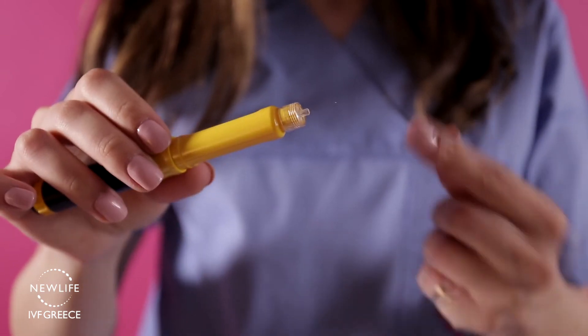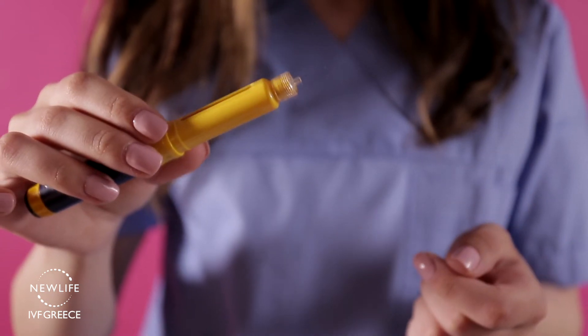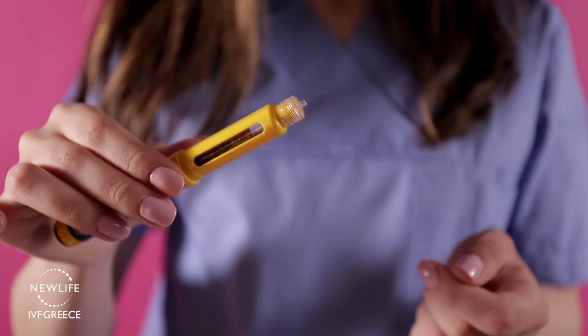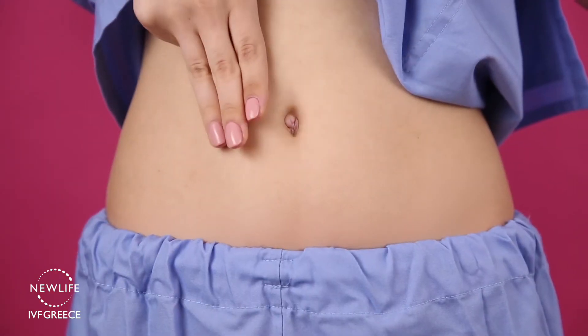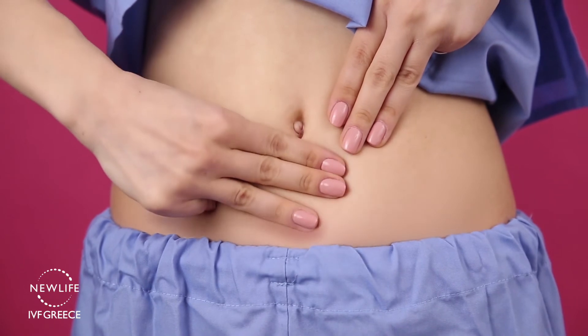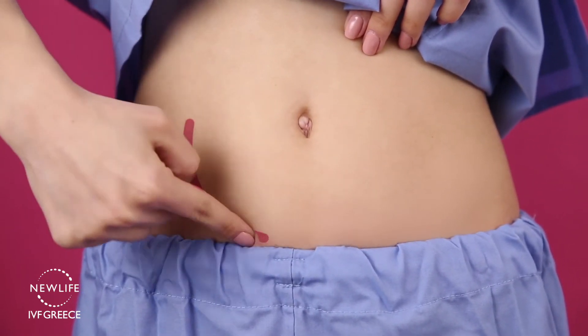The injection should be performed during night time. Please select a time between 8 and midnight to perform your injection daily. This small needle is designed to deposit the medication subcutaneously; thus, you will need to insert the whole needle into the skin. Puragon injections are subcutaneous injections that should be performed in the lower abdomen. Use three fingers placed under the belly button to find the location of the injection. Please note that it is important to rotate the injection sites.